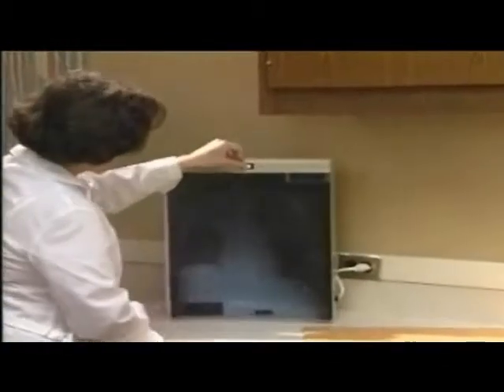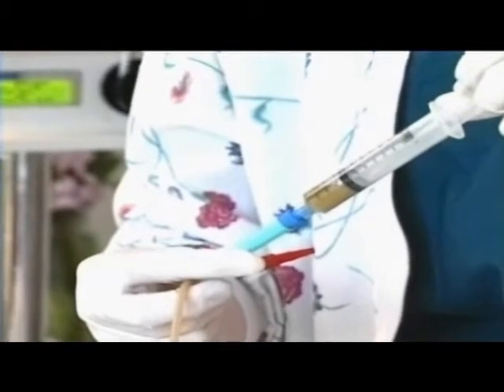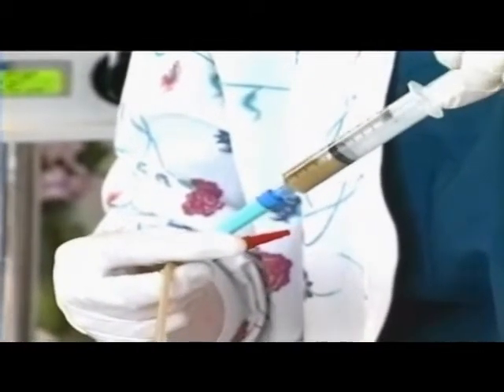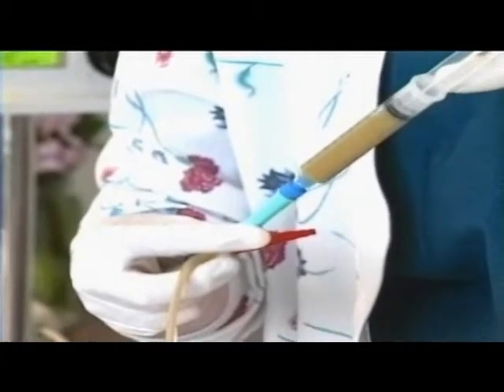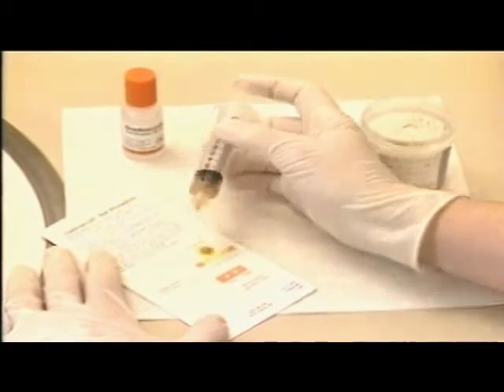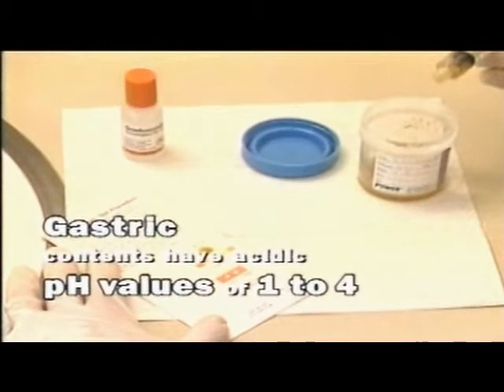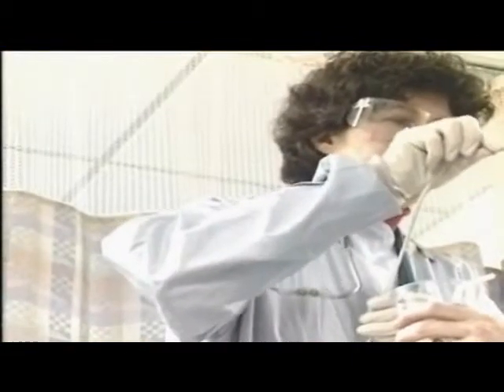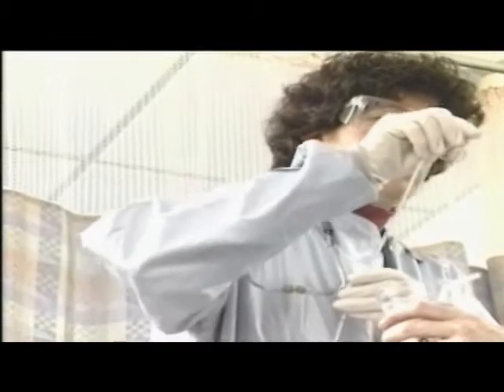Placement verification should not include auscultation alone, but should be combined with other methods — check with agency policy. Gastric content analysis may be used. To check for gastric contents, gently aspirate and obtain a small sample. Observe color — gastric contents are generally green and cloudy, but may be brown, tan, bloody, or off-white. Check the aspirate for pH with a color-coded pH strip; apply a small amount to the strip. The pH of gastric contents ranges from 1 to 4 on a scale of acidity. A pH reading greater than 4 generally indicates improper placement. If placement checks indicate the tube is not in the stomach, advance the tube 1 to 2 inches and recheck for placement.